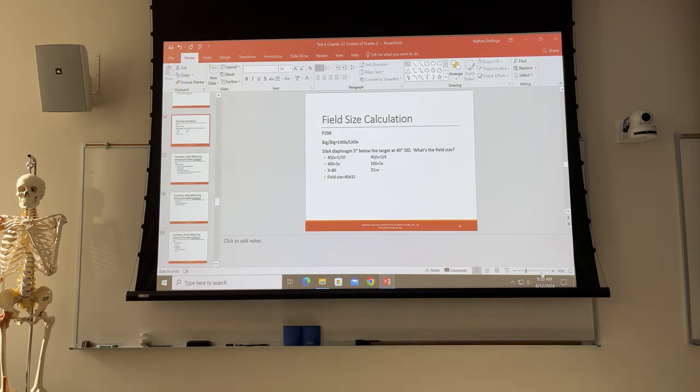Okay, so in those, what we're going to do is put those two measurements across the formula from each other. If you look at the top one, you see SDD is equal to SID, and those are both the denominators in this example. The measurement of the opening and the field size are across from each other, okay?